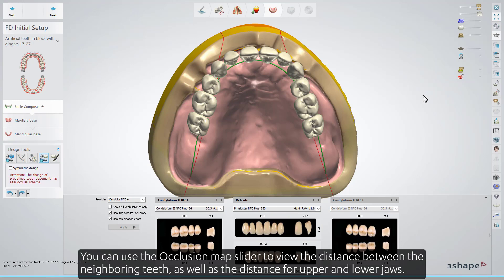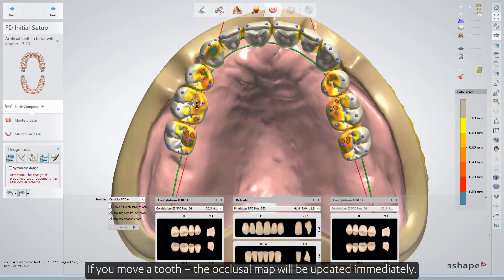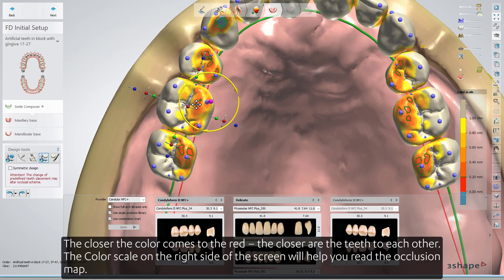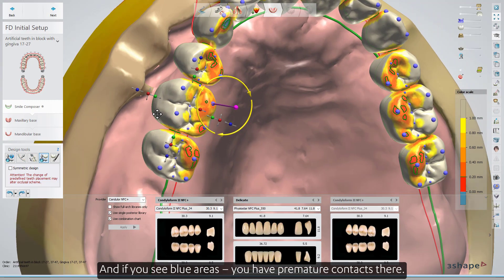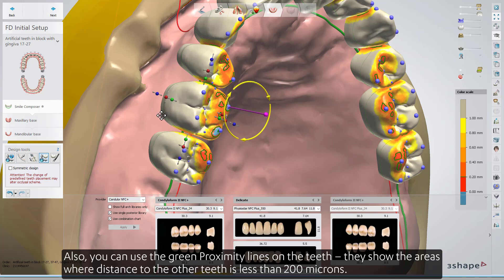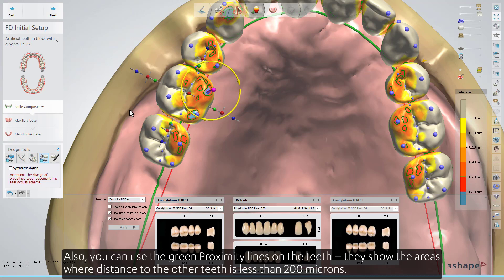You can use the Occlusion Map slider to view the distance between neighboring teeth as well as the distance for upper and lower jaws. If you move a tooth, the occlusion map will be updated immediately. The closer the color comes to red, the closer the teeth are to each other. The color scale on the right side of the screen will help you read the occlusion map. If you see blue areas, you have premature contacts there. You can also use the green proximity lines on the teeth, which show areas where the distance to other teeth is less than 200 microns.